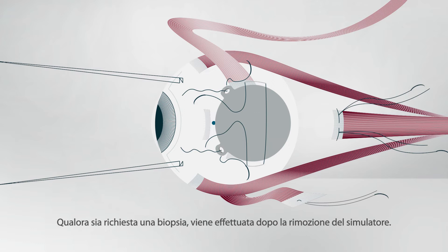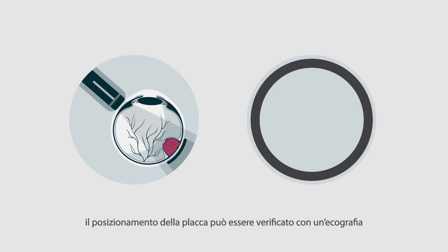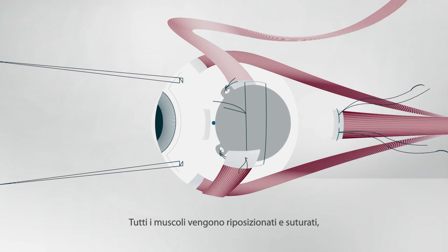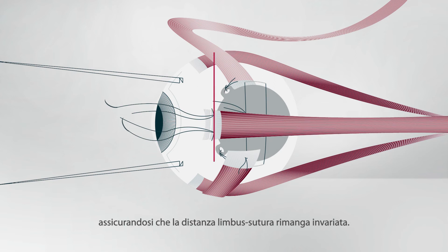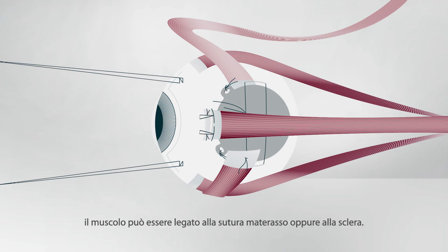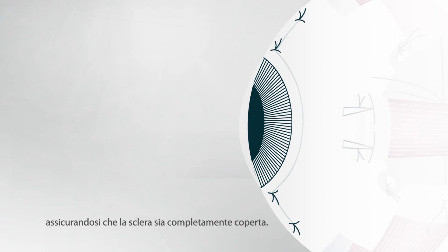If a biopsy is performed, it is done after removing the template. The sutures are tied. If a D'Amato template is not available, the plaque position can be checked by ultrasonography or by indenting the globe with the posterior edge of the plaque while performing binocular indirect ophthalmoscopy. Any detached muscles are sutured back in place, ensuring that the knot to limbus distance is the same as before. If the plaque overlies the muscle insertion, it is attached to the sclera with slings or to the mattress suture. Finally, the conjunctiva is closed ensuring that the sclera is completely covered.